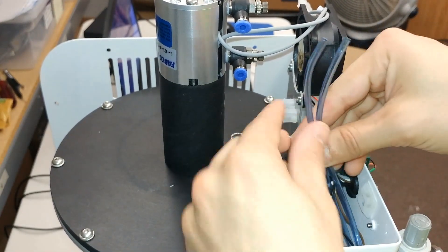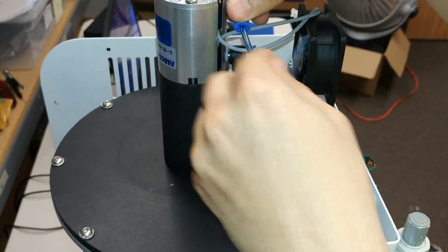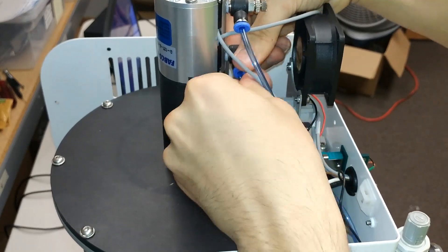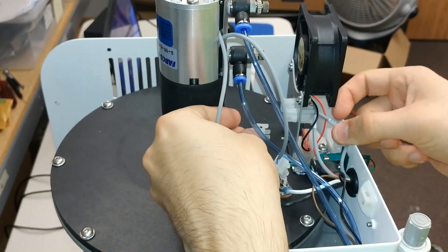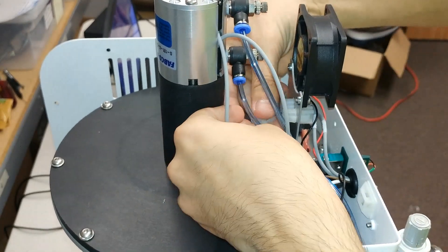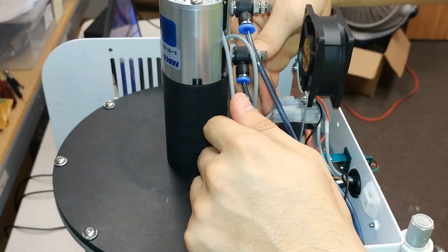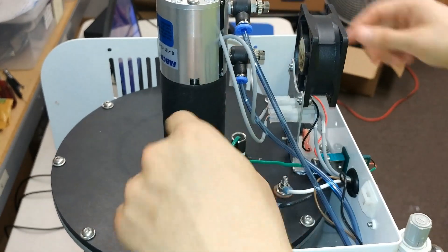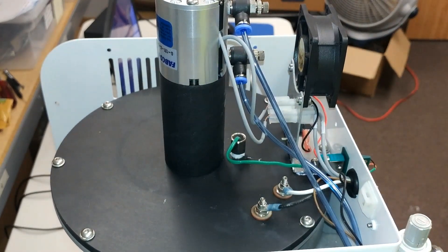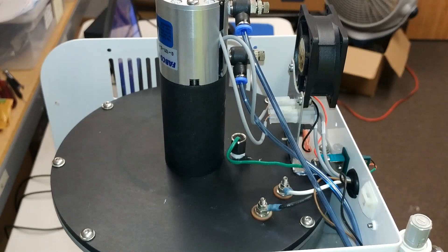Next, take your blue air hoses and connect them accordingly — the longer one goes into the top slot and the shorter one goes into the bottom slot. Lastly, connect your press sensors, making sure the upper press sensor goes into the upper cable connector and the lower press sensor goes into the lower cable connector. After everything is connected, make sure everything is tightened, locked in, and not loose. Then you're good to go — replace your covers back onto the furnace and start using it again.